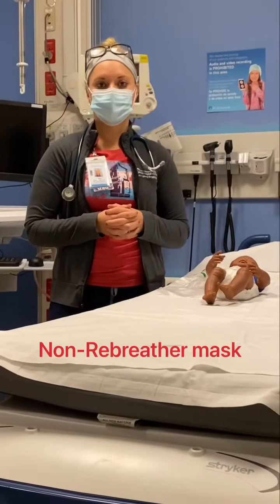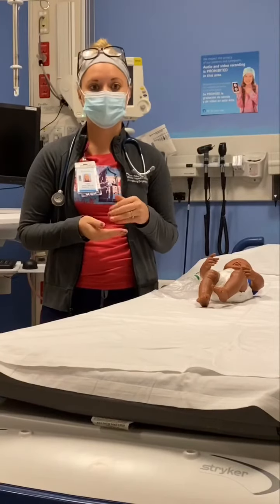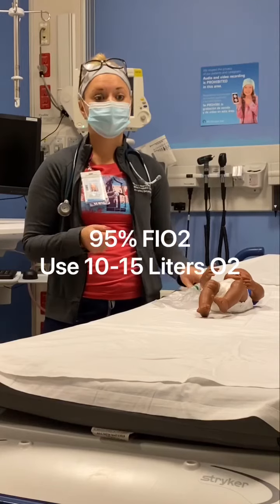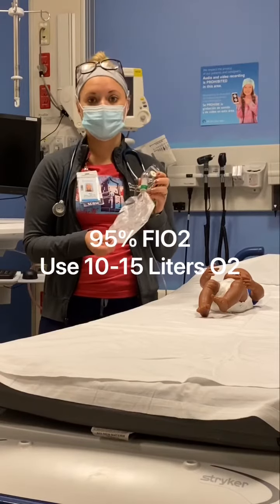I'm going to be talking to you guys about the non-rebreather mask. This mask is the highest concentration of oxygen that can be provided to a spontaneously breathing patient in the short term. The non-rebreather mask provides 95% FiO2, and you want to make sure that you're using 10 to 15 liters of oxygen.